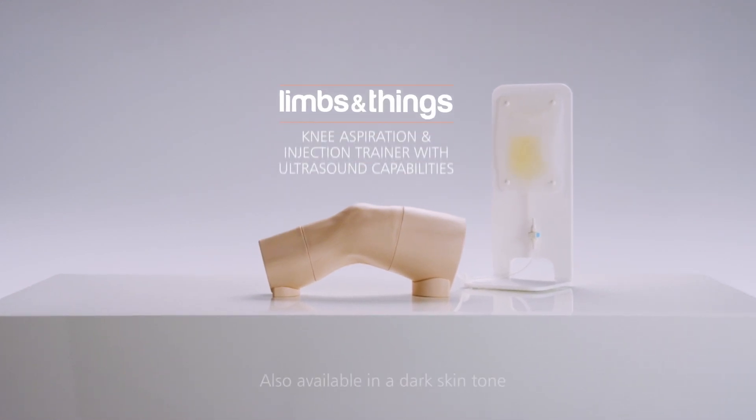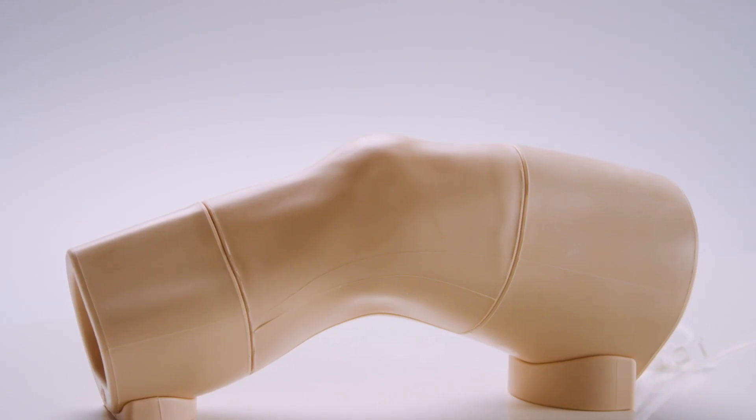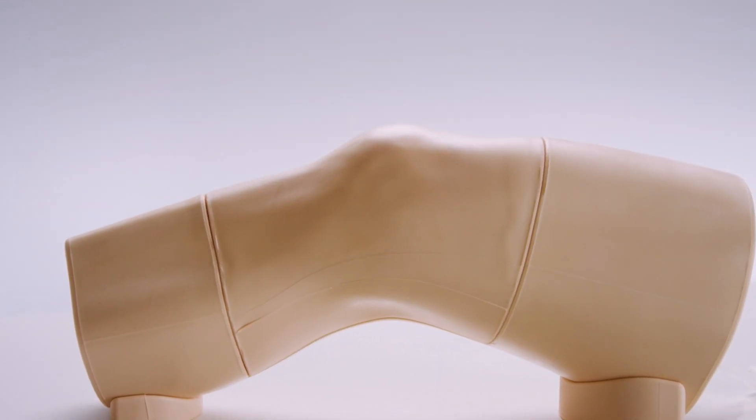This is the Limbs and Things Knee Aspiration and Injection Trainer with ultrasound capabilities. Designed in conjunction with clinicians, it is an anatomically realistic adult right knee for teaching the fundamental skills of knee aspiration and knee joint injection to both postgraduates and undergraduates.